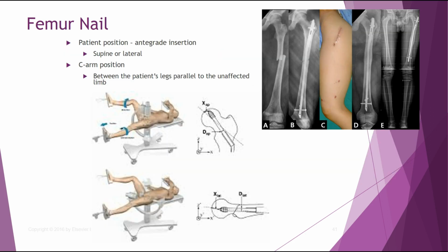Okay, this is a picture up at the top right of a patient who had an antegrade insertion for a femoral nailing. And this is a couple of pictures here of how your C-arm placement would be. All right.